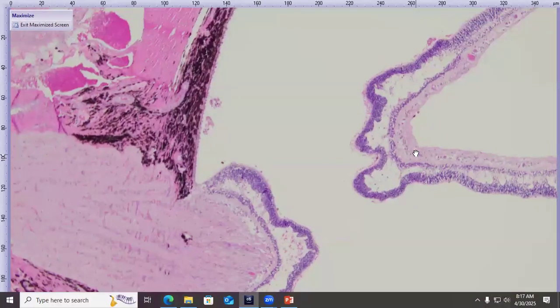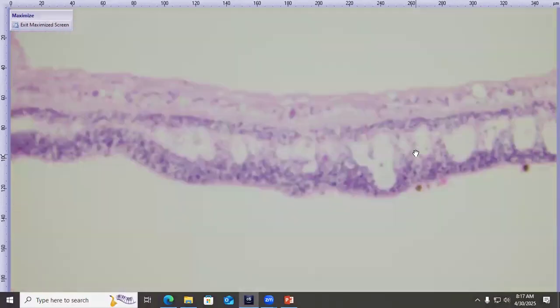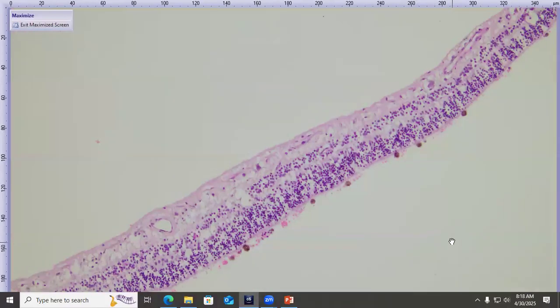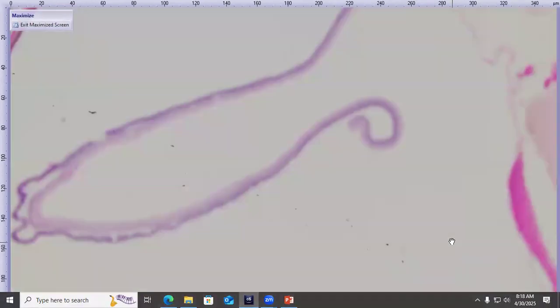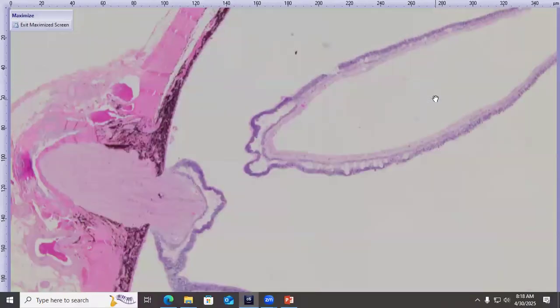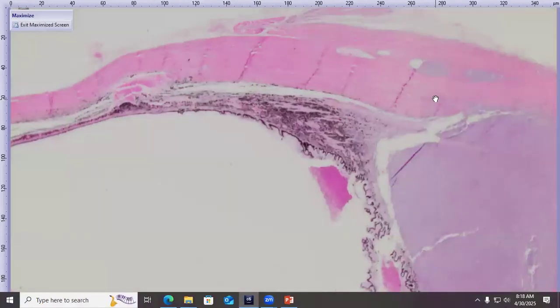And then lastly, our detached retina. There's some atrophy of the inner and outer photoreceptor segments, which, if we were doubting it at all, helps corroborate that this is a true retinal detachment. And then on top of that, we also have retinoschisis, so just this separation in the outer plexiform layer. And due to the detachment, we're unable to confirm glaucoma in this case. There's this distortion of the optic nerve head, so we can't see a true cupping. And with detachment, we won't see that inner atrophy that we usually associate with glaucoma.